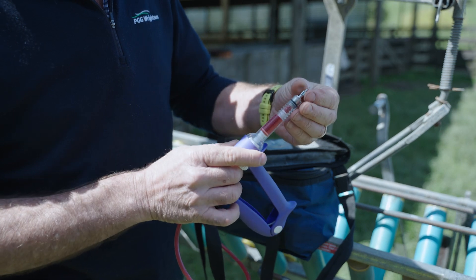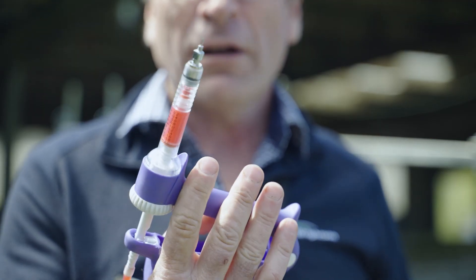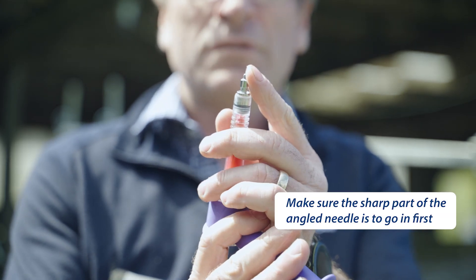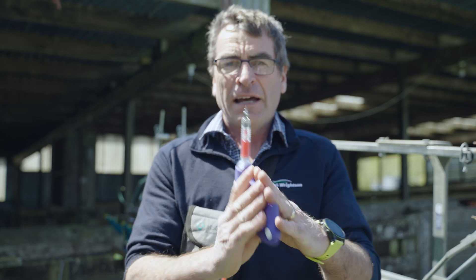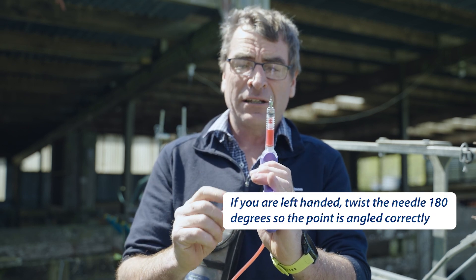I'm going to put my needle on, angling that needle. I'm right-handed, so when I'm setting up the gun, I want the sharp part of the needle to go against the lamb to go in first. If I was left-handed, I'd want the sharp point of the needle on the other side, so I twist it 180 degrees.